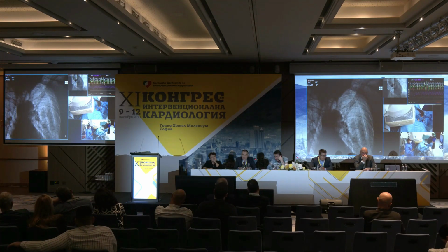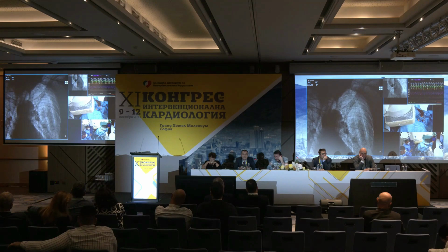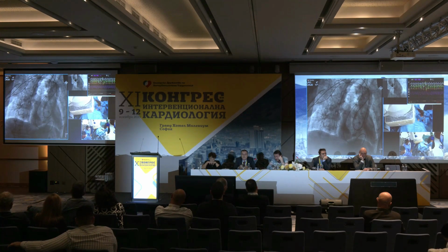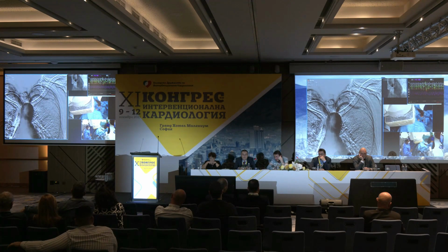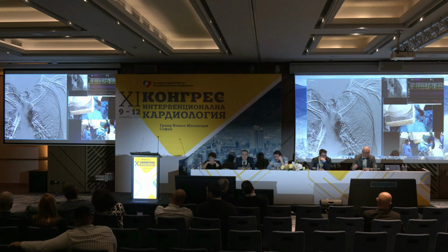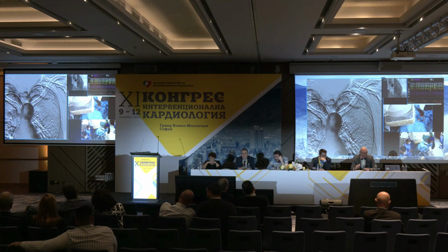And the electrode was escaped from the right ventricle, and we had to position very fast from femoral approach. We positioned a second electrode, and now she is practically totally dependent on the pacing. And it was expected, and probably she will need, of course we are going to wait till tomorrow, but probably she will need a permanent pacemaker. And that's it.